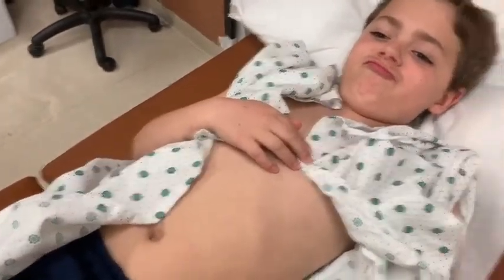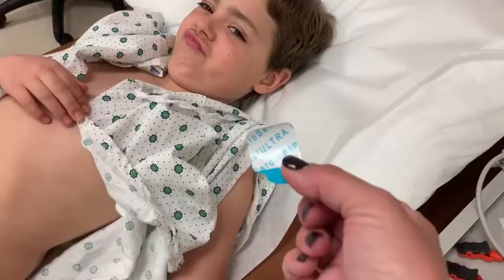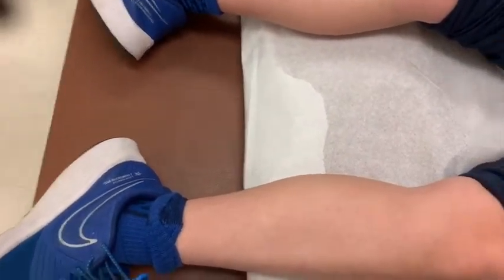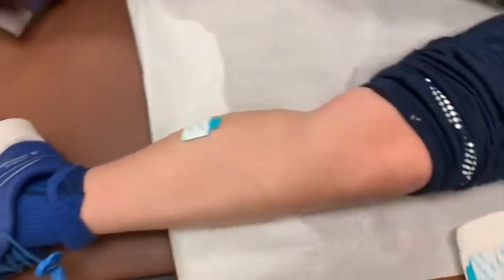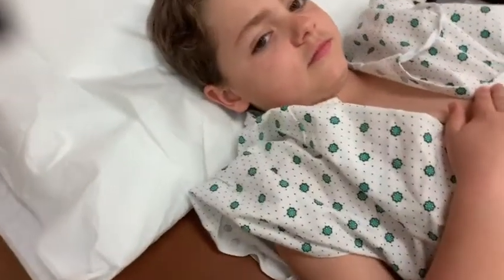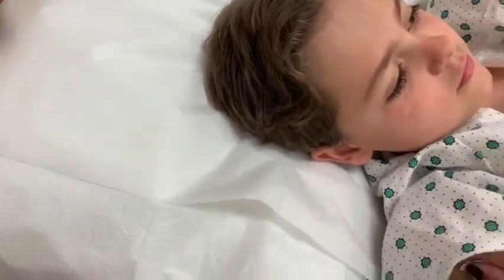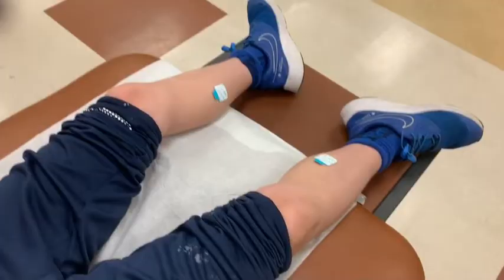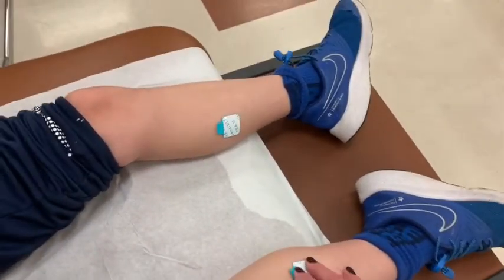So now what I'm going to do is put these little tabs on his arms. See how the tabs are here — we're just going to stick it on there just like so. And we're going to come down here to the legs and go ahead and put that tab right where we cleaned. Then we're going to come on up over here to the other side and put one on his upper arm as well. So those are my limb leads — both arms and both legs. The right leg, as I mentioned in the lecture, is a ground wire. This is what creates the entire circuit for the EKG.